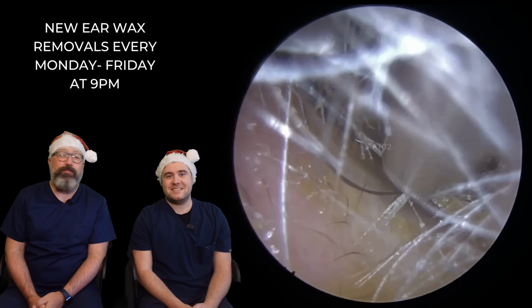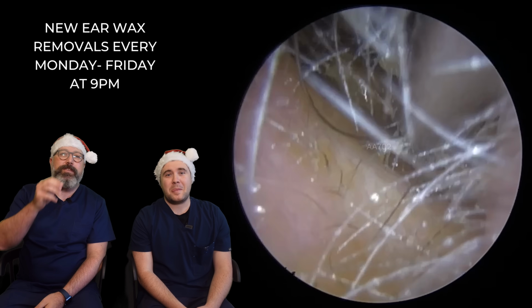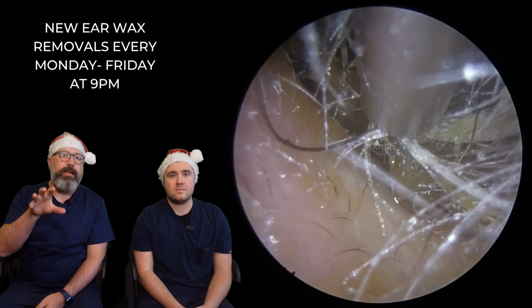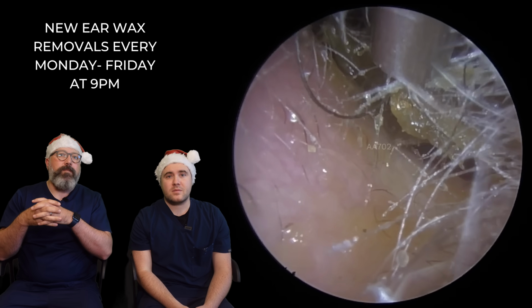Now, we can't decide which one of us did this video, so I think it might have been me, but we can't quite remember. So this one's got a really, really hairy ear canal, very dense cilia on the outer part of the ear canal. Yeah. And very dry wax.